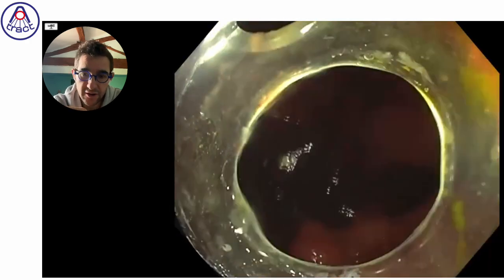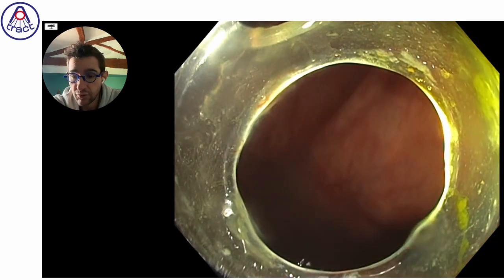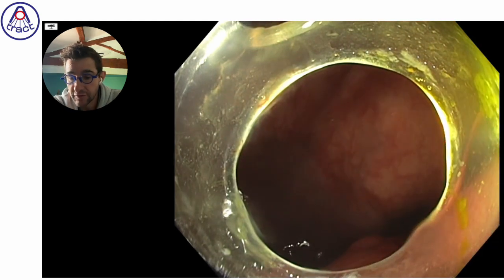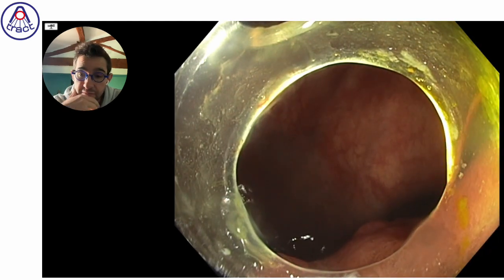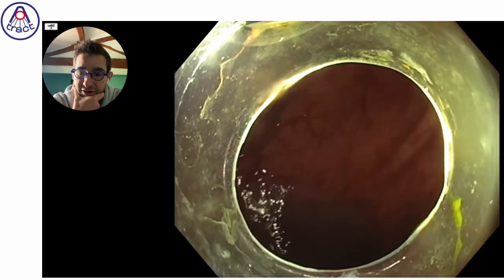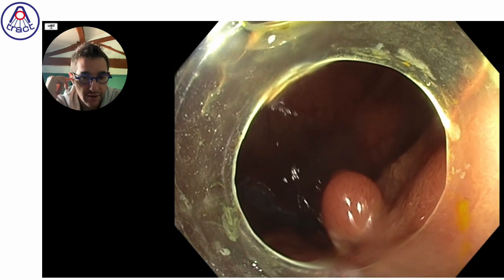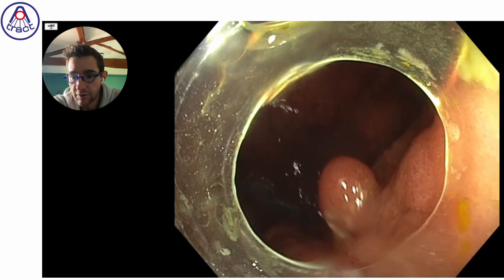But unfortunately, the best option to fix the traction would have been to put one of the traction points on the cecal side, but because the clip we use is relatively rigid, more than the knife, you will see that the traction will not be easy to fix on the oral edge.